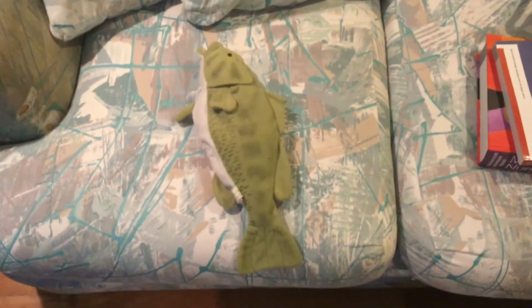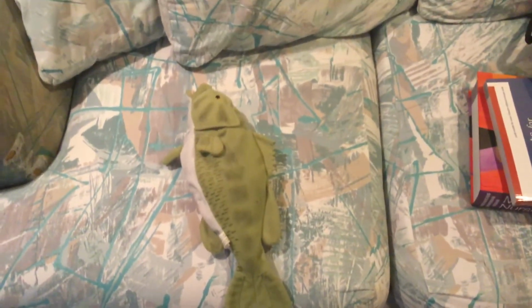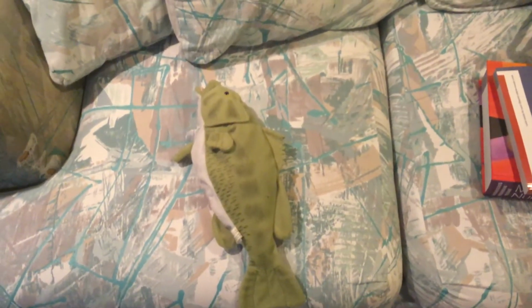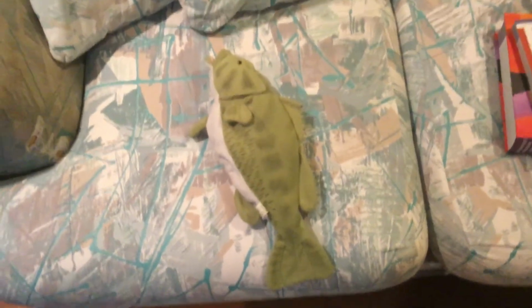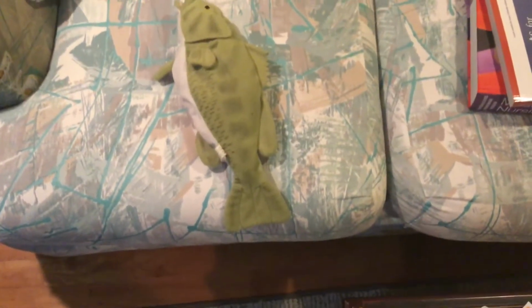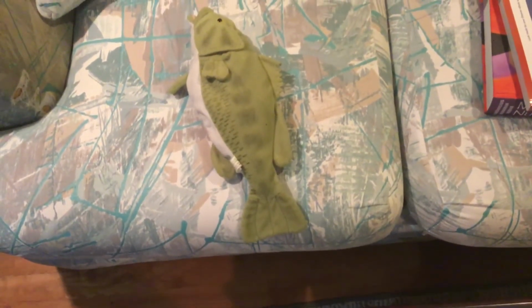Raise the bed to a working height. And if necessary, I can check apical heart rate, check blood pressure, do a pain assessment. Ask if Steve has any pain, abdominal discomfort, tenderness, or any abnormal bowel sounds. I will then position the bed to high Fowler's. I will then don gloves, position the stethoscope just below the costal margin.